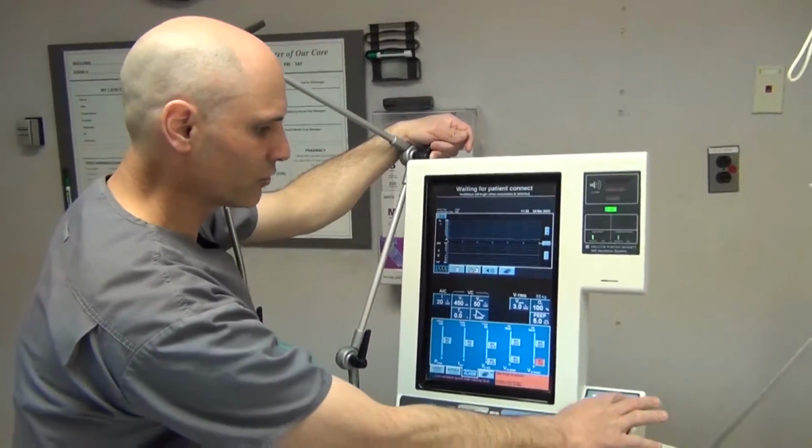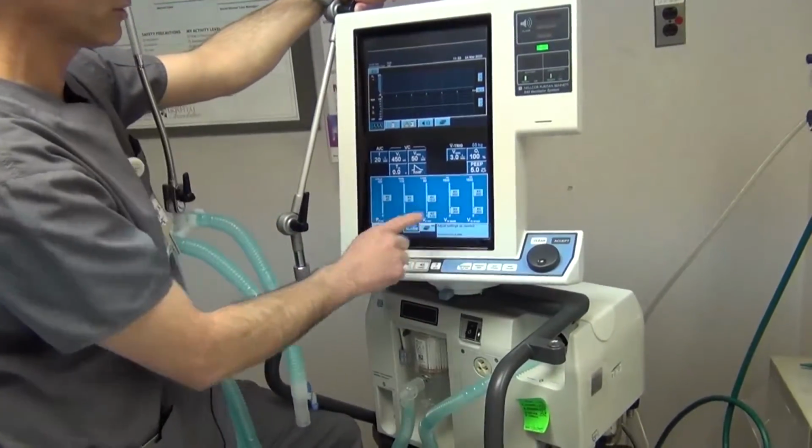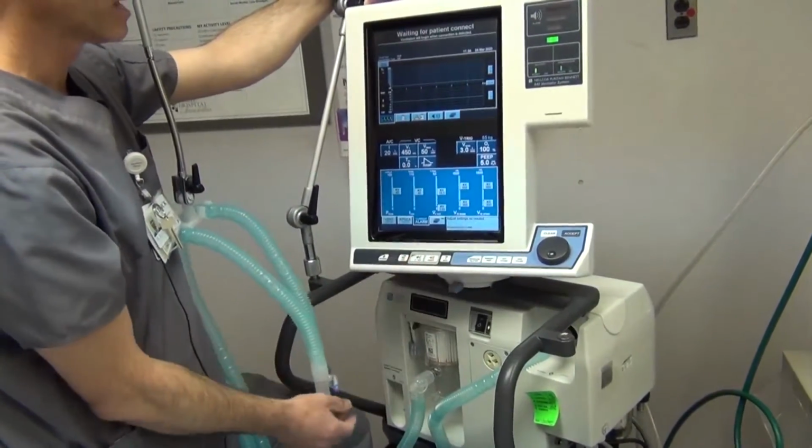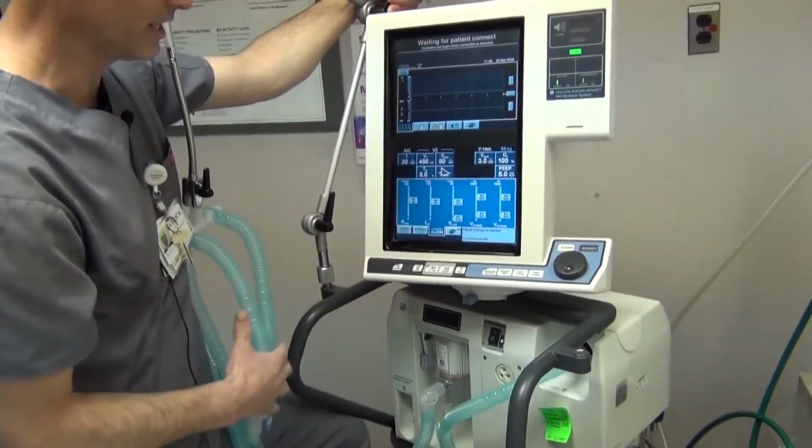After you've set those, you'll hit accept. Notice these are all red, the ones we've changed. When we hit accept, they'll change to black, so we know that's set. And that's essentially what we need to set up for the machine.